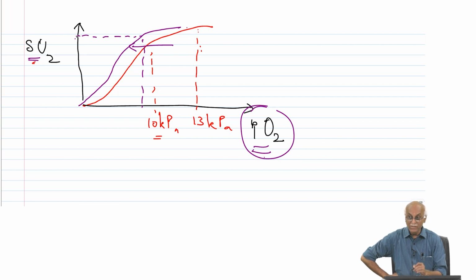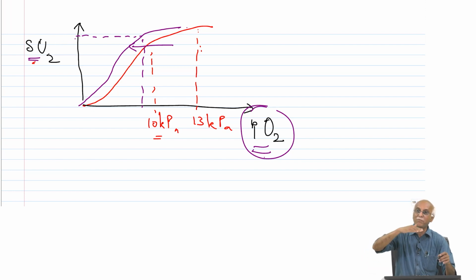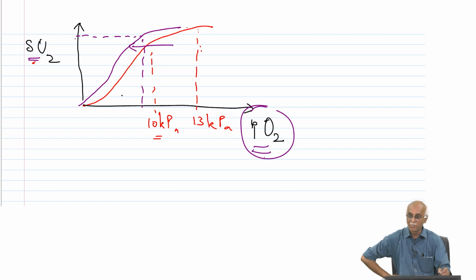What it means is that the oxyhemoglobin which is required for the tissue to carry on its metabolic activities decreases, so there is an oxygen deficiency. However, saturation does not capture this information, because it will always give you an oxygen saturation of around 90 or 95%, but actually the partial pressure of oxygen associated with oxyhemoglobin has decreased.